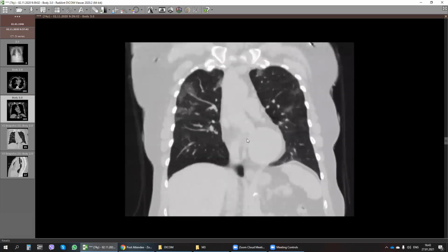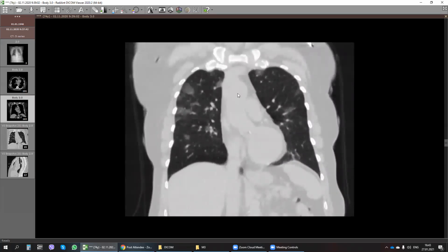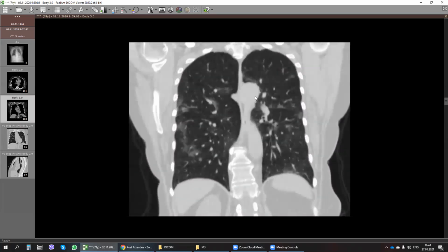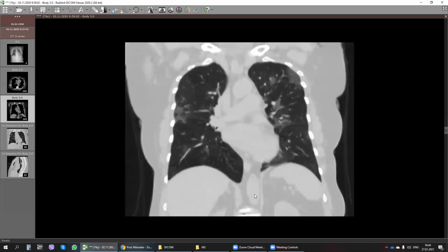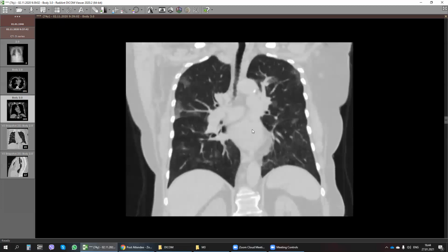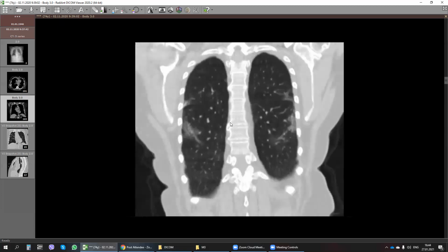We can see the aorta here. This is the aorta, aortic arch, and it goes down, down, down to abdominal. This is already abdominal aorta. So this is descending aorta and abdominal aorta. Also, we can visualize vena cava.